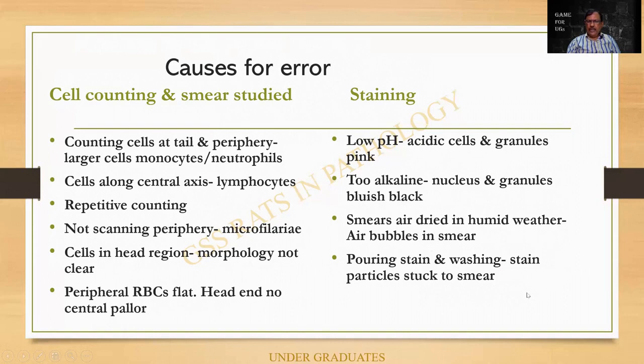This is a common mistake that the technician and the student will make after the staining is complete. Even though they have done it correctly, they pour off the stain and try to wash it under the tap water. When we pour off, all the Leishman particles will stick on to the smear and you cannot get rid of them. Instead, what we should do, I shall be explaining.